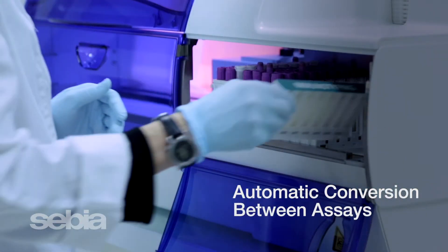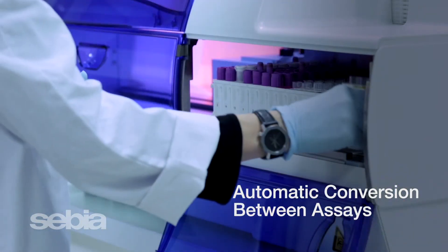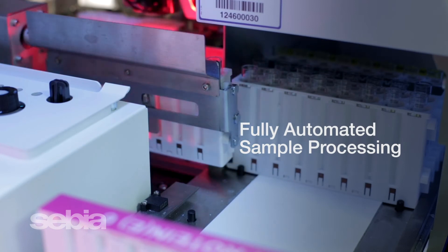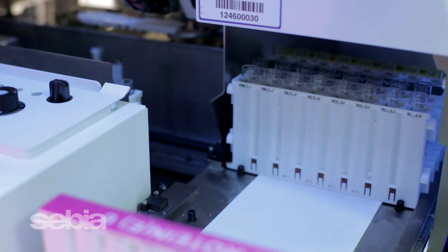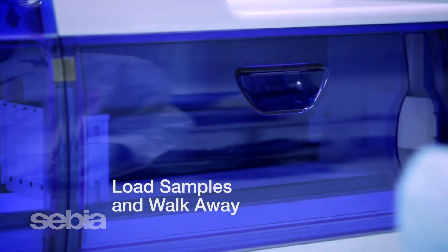You can effortlessly and automatically switch between different assays with the reagents already on board the analyzer. The Capillaris 3 handles all sample processing automatically, from sample mixing for whole blood assays, primary sample tube barcode reading, sample dilution, and analytical testing. The system truly allows users to load samples and walk away.